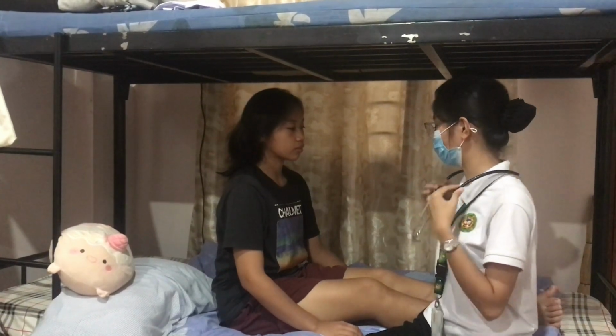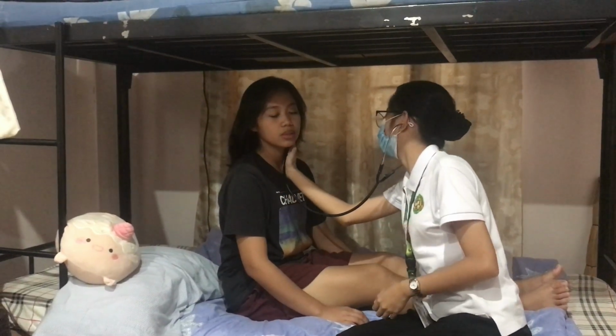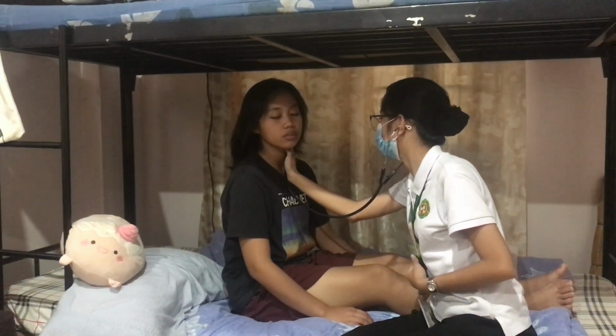Next is to auscultate the carotid area. Ma'am, upo po tayo. Yung ulo po. Kabila naman po.